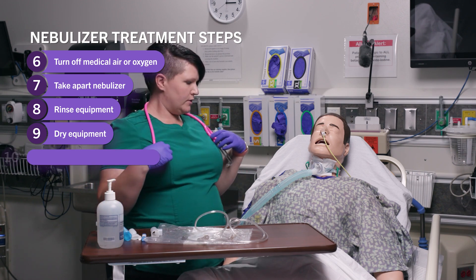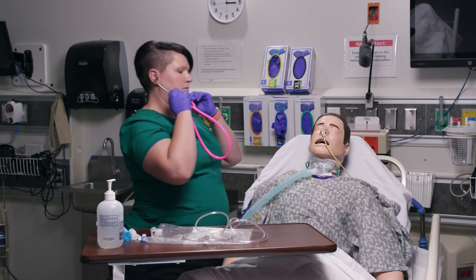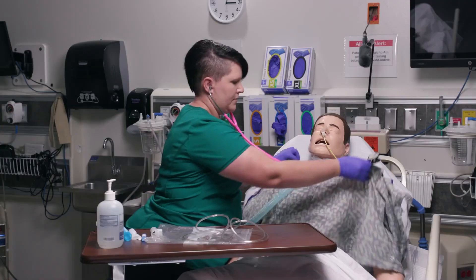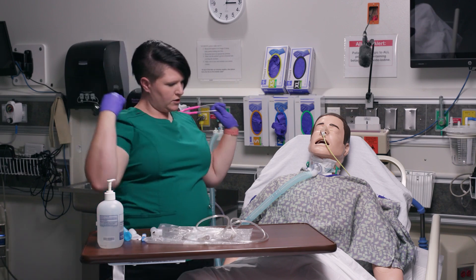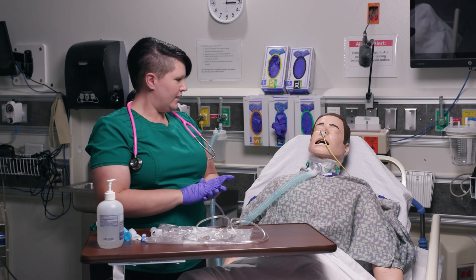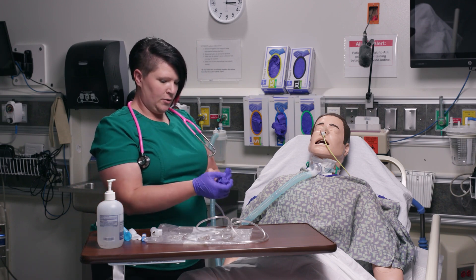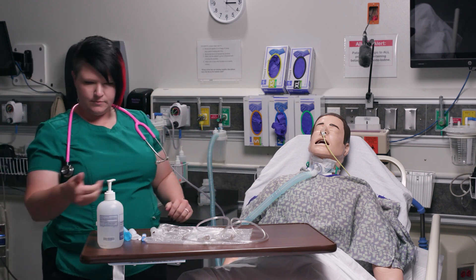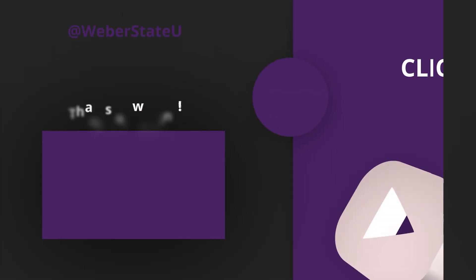Now that I'm done and I've rinsed the equipment, Mr. Jones, I need to reassess your lung sounds. That wheezing sounds a lot better, Mr. Jones. Your respirations are now down to 18 and you're breathing regularly. Can I get anything else for you? I'm going to take my gloves off, throw those in the garbage, wash my hands — and that is how you administer a nebulizer to a patient.